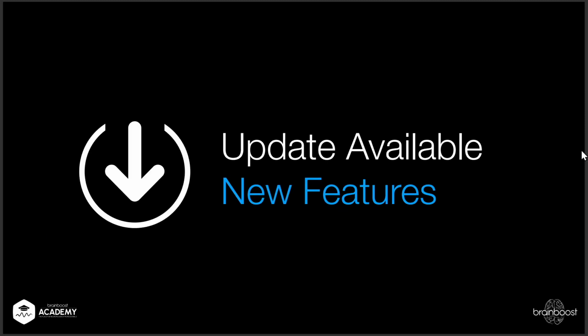Before that, there's a new update available in your BrainAssistant. Once you start it and you have an internet connection, top right, it says update available. Please do that update because it comes with a really cool feature we added to the BrainAssistant. I will show that first, just very briefly, because this webinar will be recorded, so you can rewatch it if I'm talking, I know, fast. But this is something you're really going to benefit from.